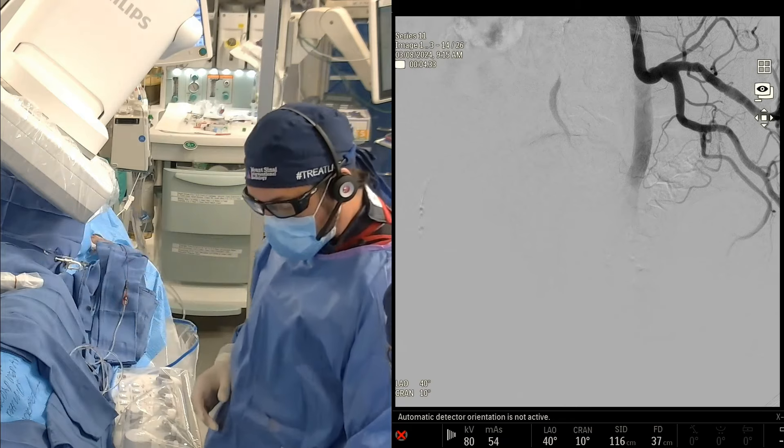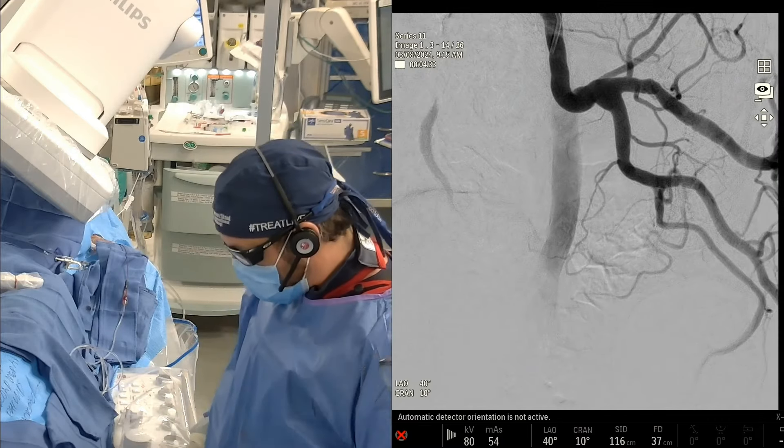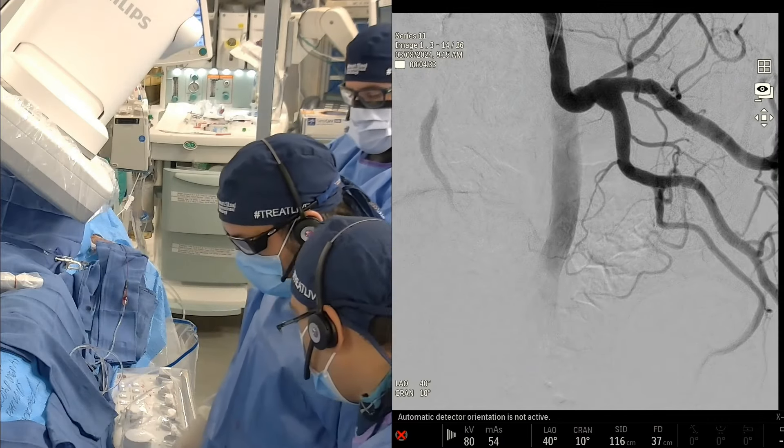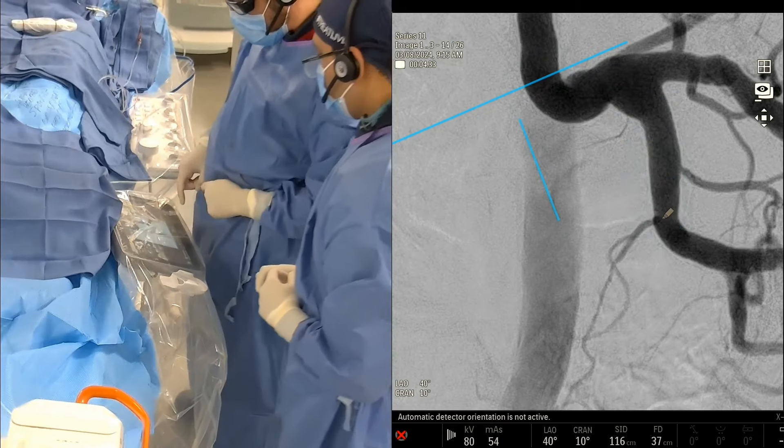Puneet was showing me before how to do this. I'm going to pull processing and zoom in here. I'm going to start drawing on the screen — this is our new Phillips room, so you can do all this fancy stuff here. This is the SVA right here, as we all can see.